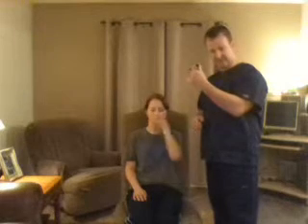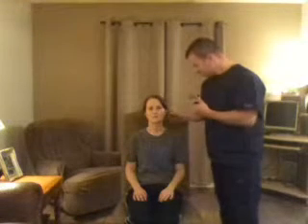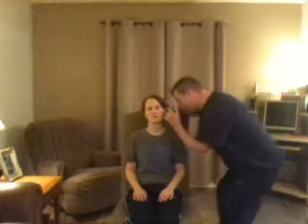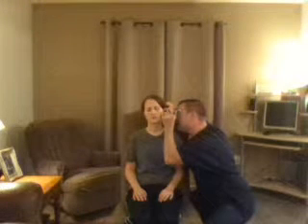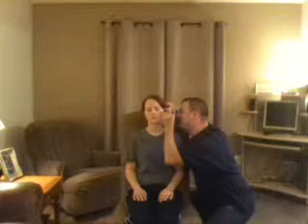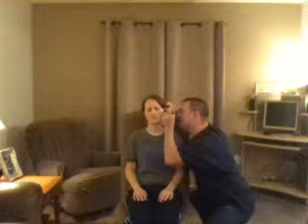At this point, we're going to take our otoscope. We're going to get our light source on here. I'm going to hold it in a pencil grip, using, again, my pinky as kind of my rudder for the face. Using my other hand, and again, it's left hand to left ear. It would be right hand to right ear. I use my other hand to grab hold of the pinna and pull up and back. And then I start observing the outer surface, and then slowly place the otoscope into the ear, observing the ear canal, moving until I find the tympanic membrane.